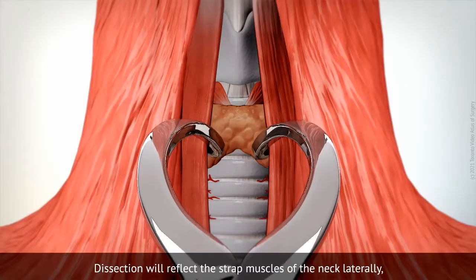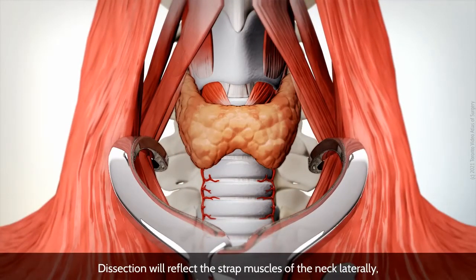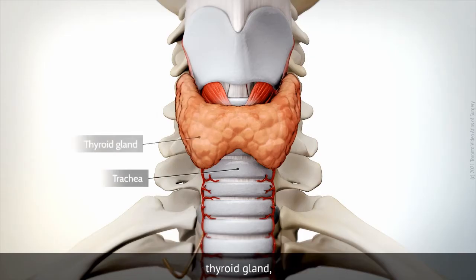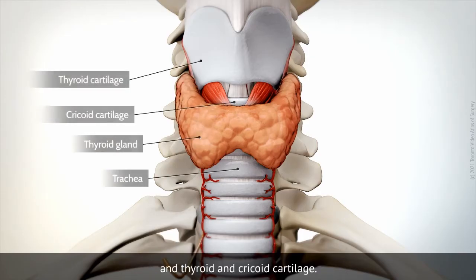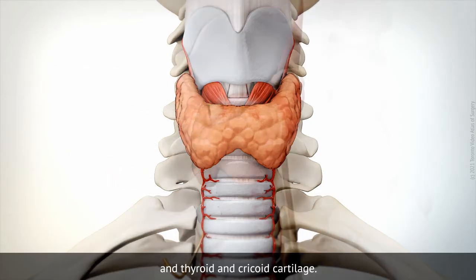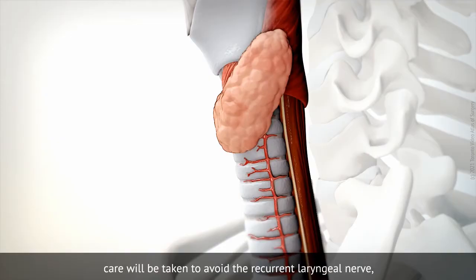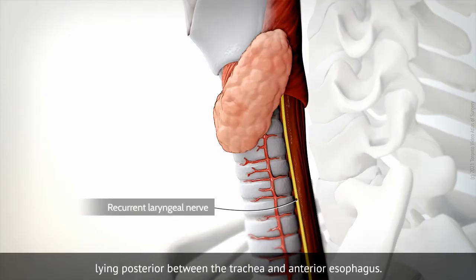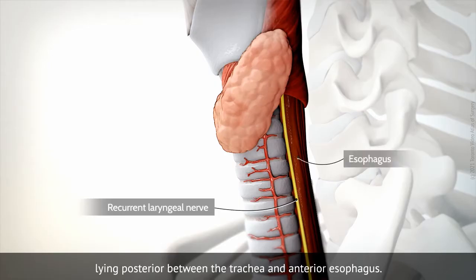Dissection will reflect the strap muscles of the neck laterally to expose the anterior surface of the trachea, thyroid gland, and thyroid and cricoid cartilage. Throughout the procedure, care will be taken to avoid the recurrent laryngeal nerve, lying posterior between the trachea and anterior esophagus.